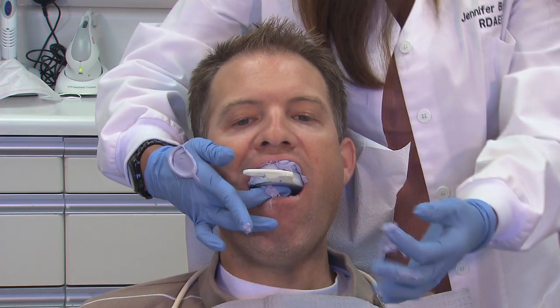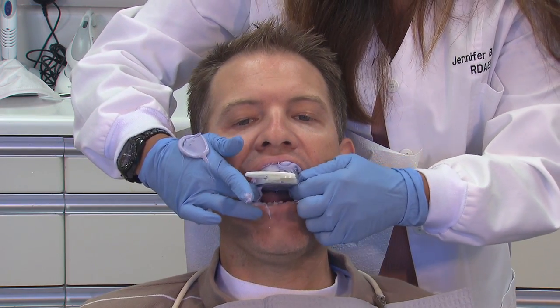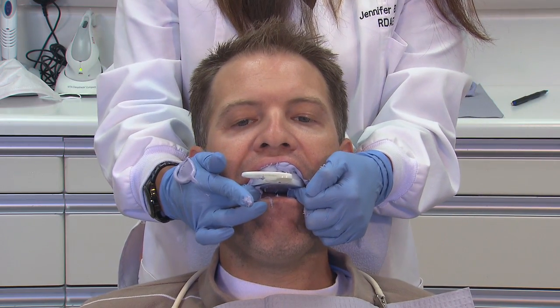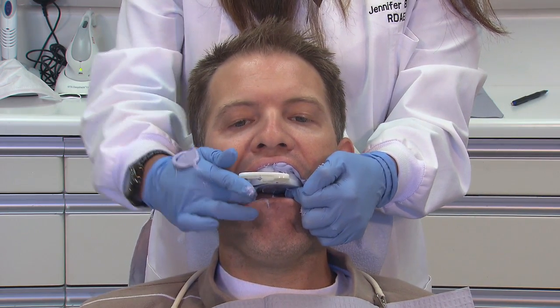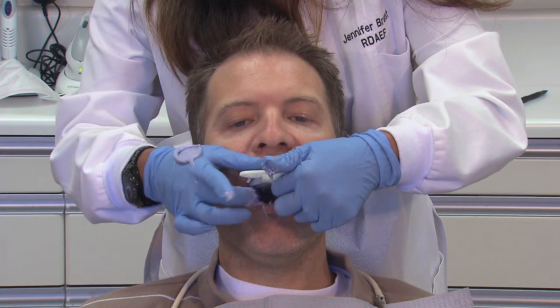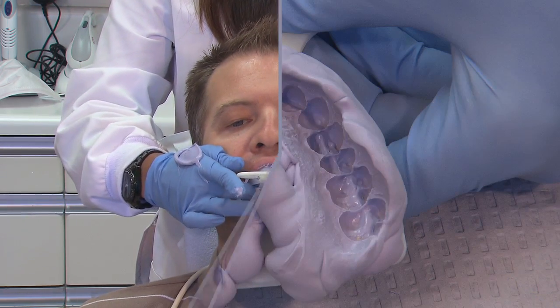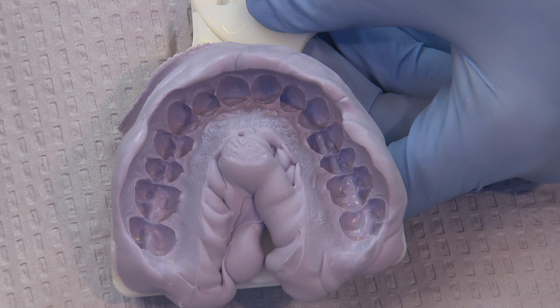So I like the alginate replacements, especially if you're sending stuff to our laboratory, because you do send stuff via the mail, via FedEx, to us. If you're sending us an alginate from Pennsylvania, by the time it gets to California and has been in the 120-degree back of a FedEx truck, the chances of the alginate distorting are actually pretty high. So we get a lot more dimensional stability with the alginate replacement material, and it can be poured multiple times.